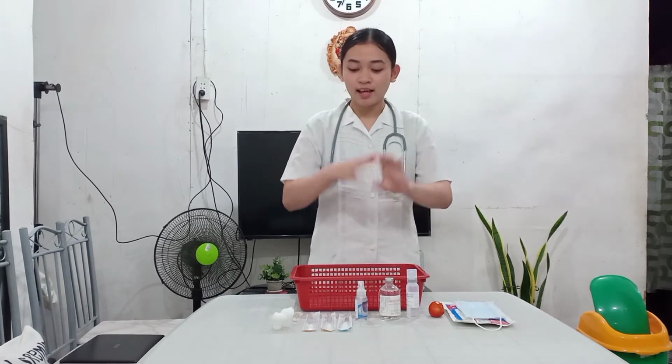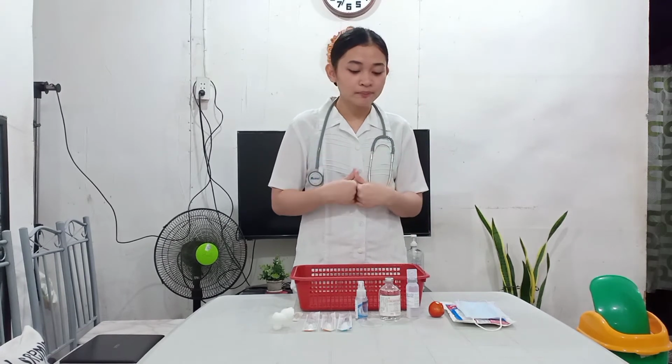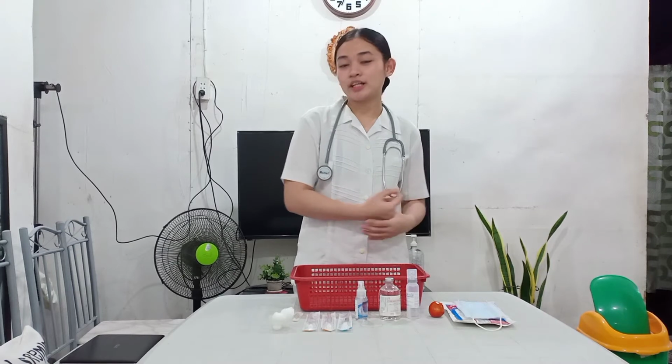So prior to carrying out the procedure, we have to prepare the things and the equipment that we will be needing in parenteral medication administration. So I have gathered here the things that I will be needing in the following procedures.